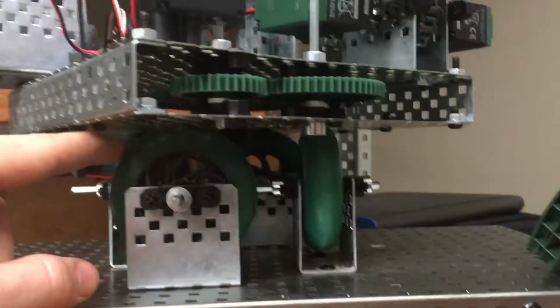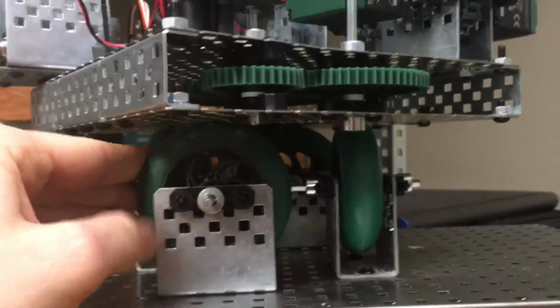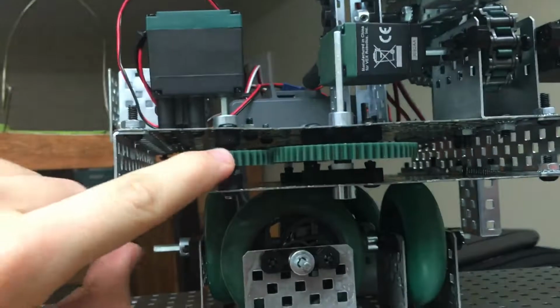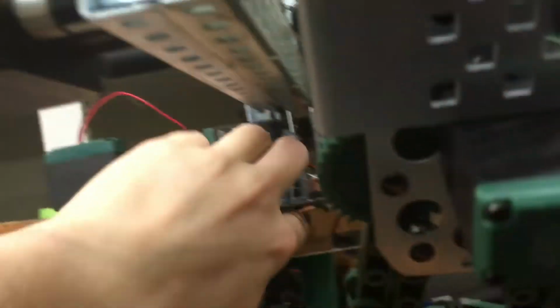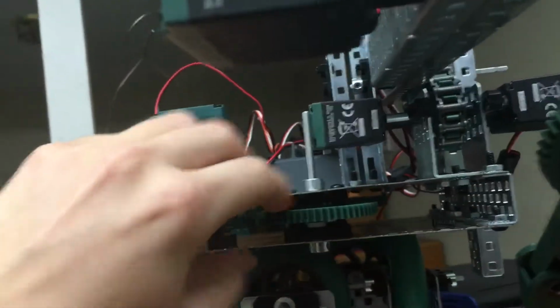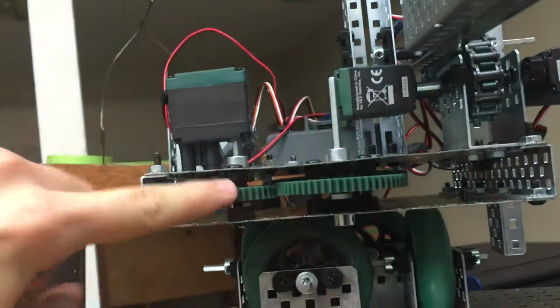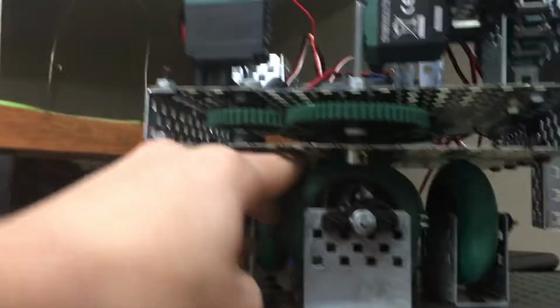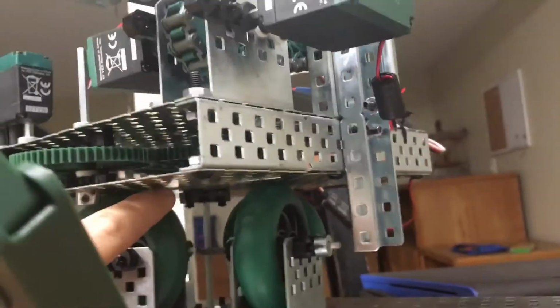But first to talk about would be the base with its wheels and this gearing system. So the motor powers a small gear, to a medium gear, and on the inside down in there, a big gear that is fixed. These continue to move with the base, and they drive it around, and it's balanced on these 4 wheels all around the bottom side that guide it and give it a smooth ride.